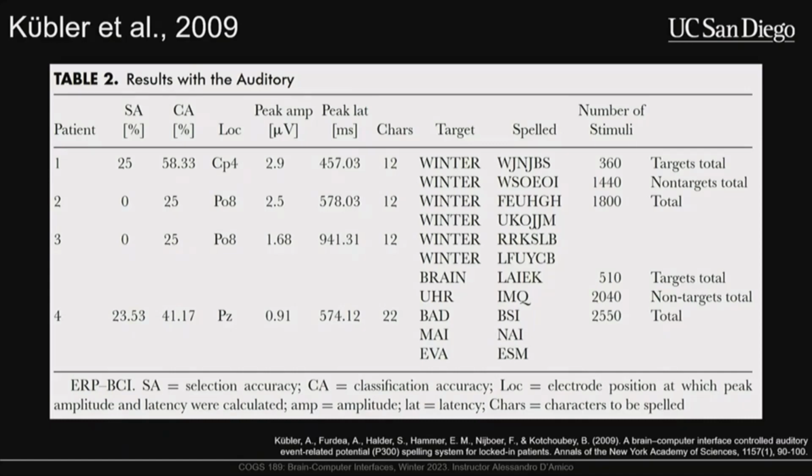You can calibrate things on a much smaller corpus, and you can tell participants which words are allowed, and you can end up getting better spelling accuracy with a combination of the BCI stimulation and a language model. So in this case, at least the first participant would benefit from this, because there are probably not that many words of this length that could be autocorrected to anything else but winter.